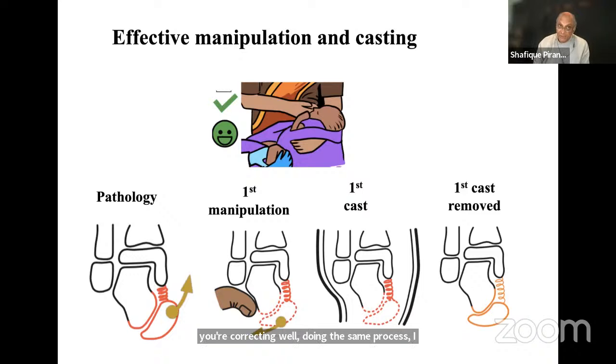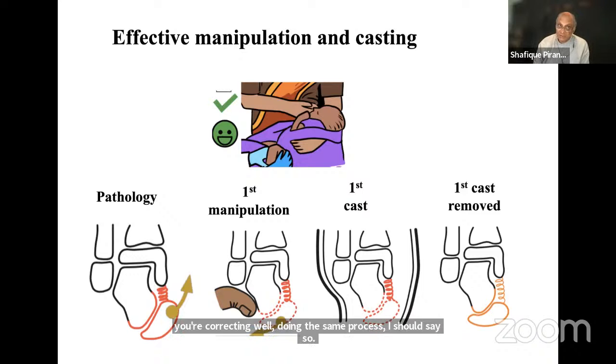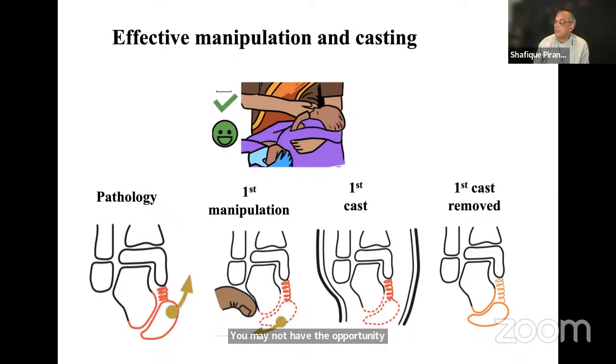So you may not have the opportunity to evert the subtalar joint in your measuring of ankle dorsiflexion. So my own idea is I try and estimate the amount. I do the Ponseti maneuver, I supinate the foot, I abduct the foot with counter pressure on the head of the talus, and then I look at the lateral border of the leg and the lateral border of the hindfoot, and I see where am I? Am I still in plantar flexion? If so, how many degrees of plantar flexion?